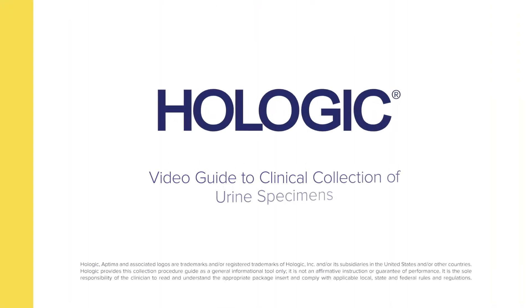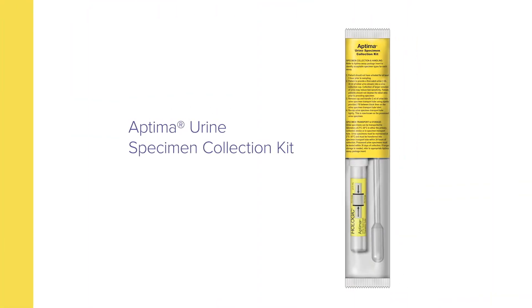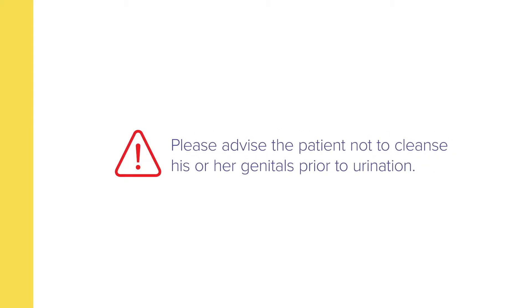Hologic presents a video guide to the collection of urine specimens by clinicians using the Aptima Urine Specimen Collection Kit. Note that the patient should not urinate for at least one hour prior to specimen collection. Please advise the patient not to cleanse his or her genitals prior to urination.